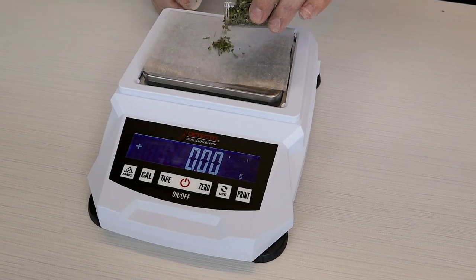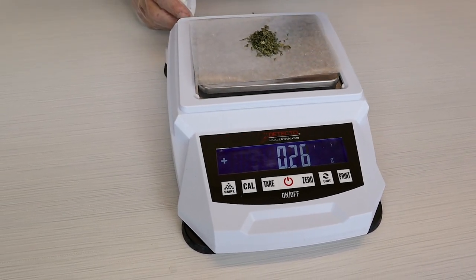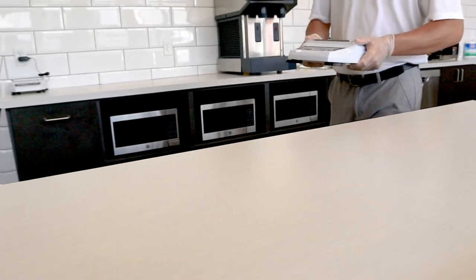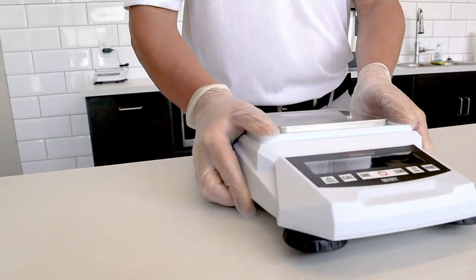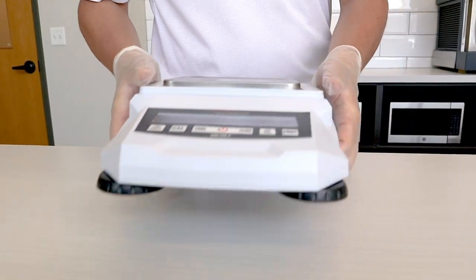Watch how fast the scale stabilizes and displays weighing results quickly and accurately. The 420 series is lightweight, weighing only 4 pounds or 1.8 kilograms. It's easy to carry in the field for weighing samples anywhere, anytime.